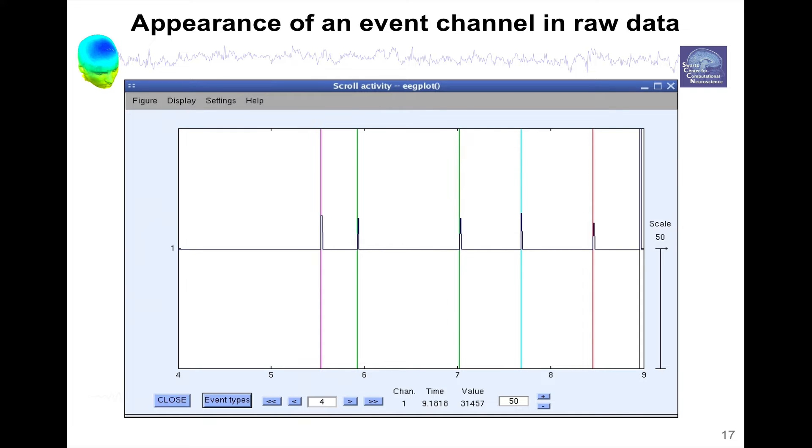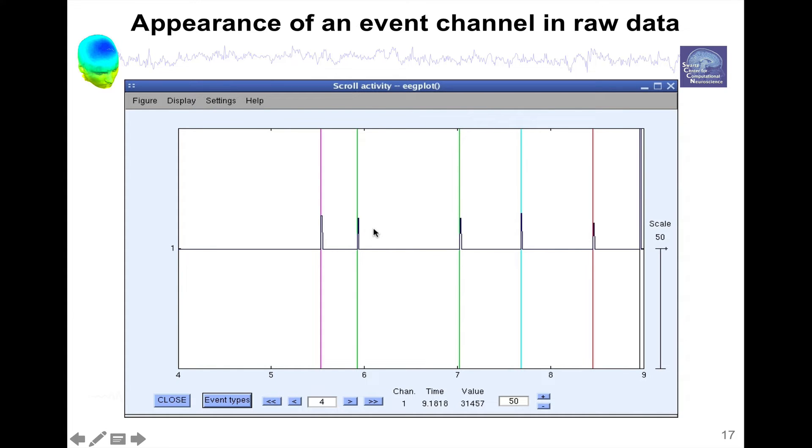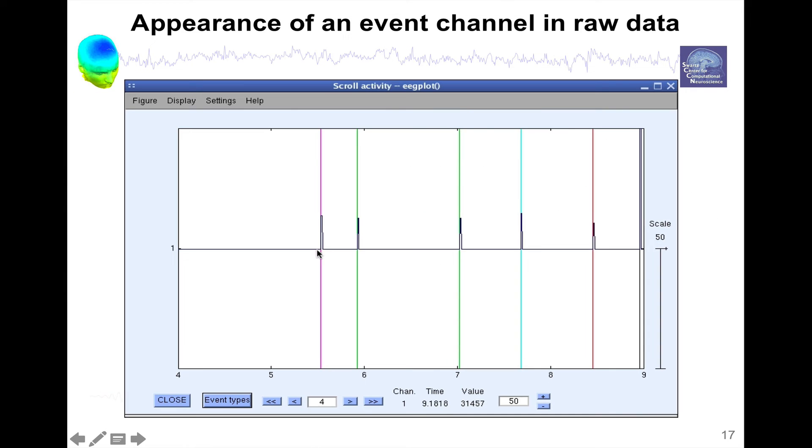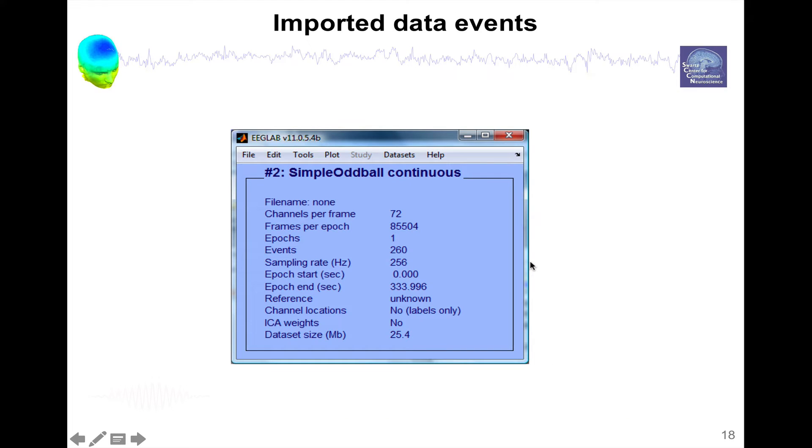It has extracted them on the leading edge of the signal. If there was a checkbox here, all events of the same type. If you click that checkbox, then it will only extract one color, one type of event irrespective of the amplitude.